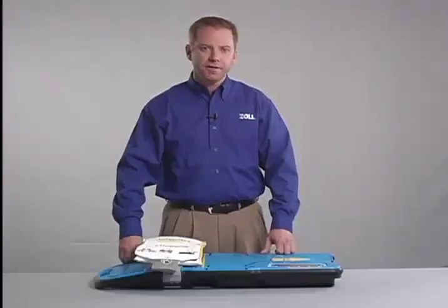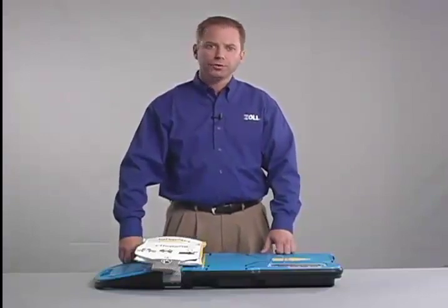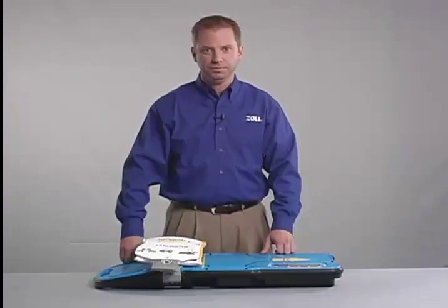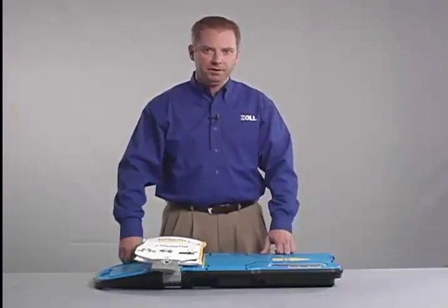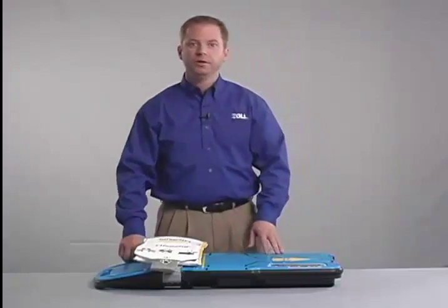A new, single-use lifeband should always be installed along with a freshly charged battery in order to ensure the Autopulse is ready for immediate deployment. To change the lifeband, make sure the Autopulse is powered off, then turn the board over.